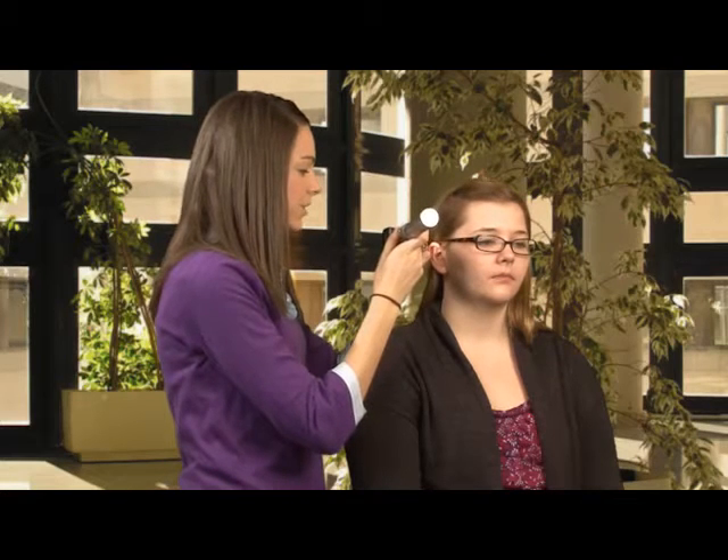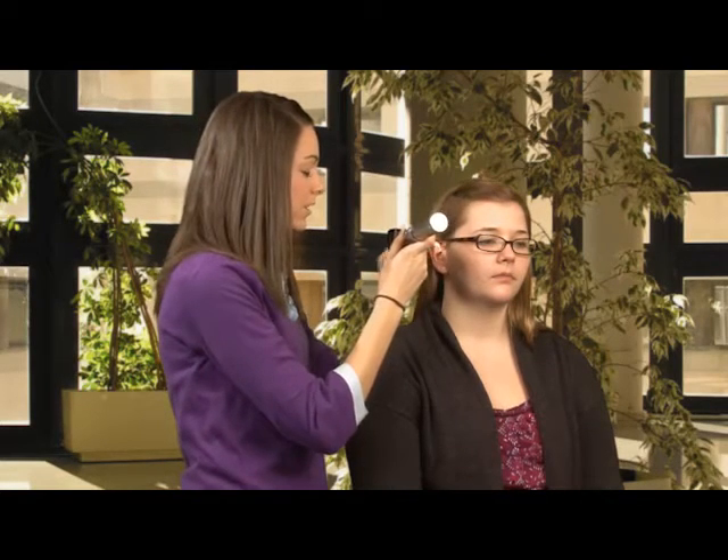The next thing I'm going to do is turn my otoscope on. You do that by pressing this little green button and twisting, just like that, and then it turns on and you can see the little light. Now I'm going to shine the light on her external ear, which is called her pinna or her auricle.